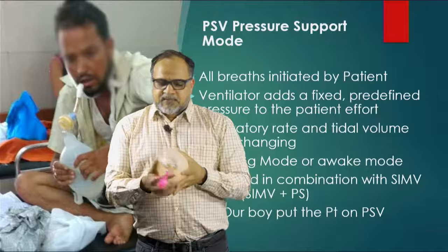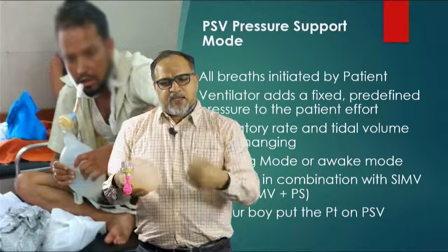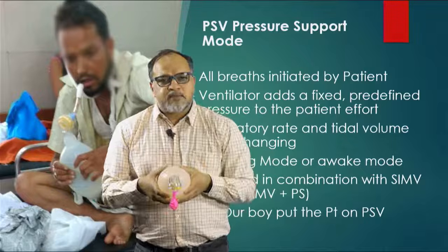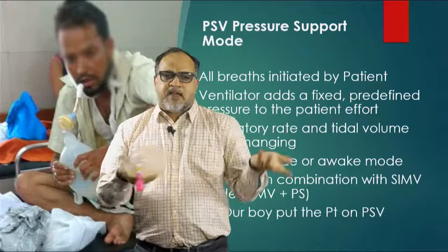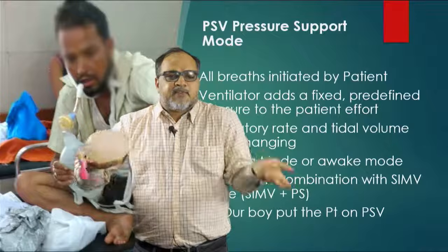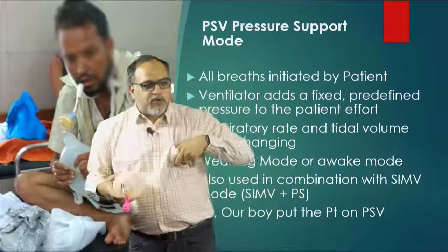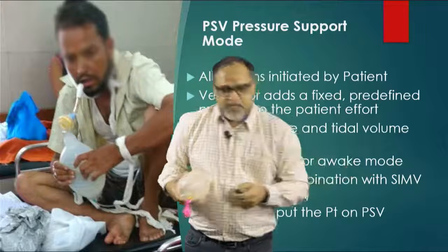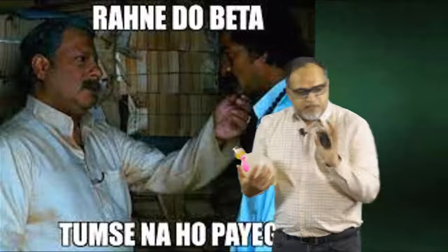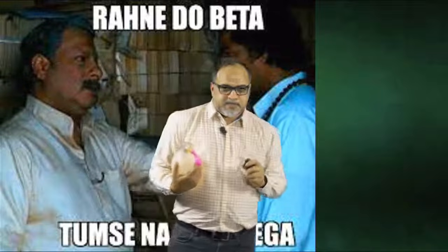So what happened was that our boy was ventilating the patient. Then somebody came and gave like 2-3 ml of midazolam to the patient. The patient stopped breathing. The boy kept waiting. Well, I have been told when the patient triggers, you have to ventilate. The patient never triggered, I never ventilated. In the morning, the Baba was there, obviously. So the HOD, Ramadhir Singh ji, he just bid goodbye to the ward boy. Then a new mode was discovered.